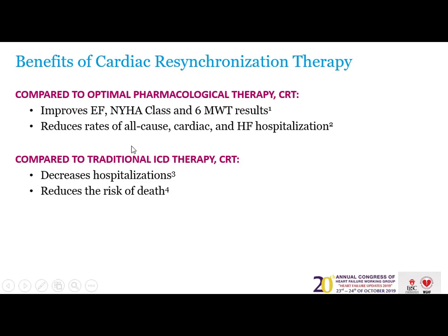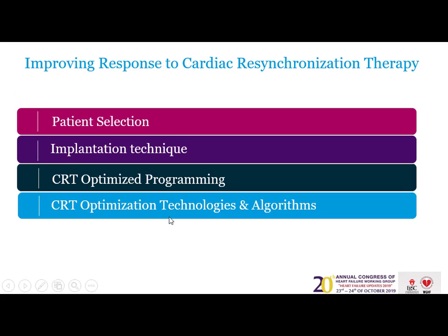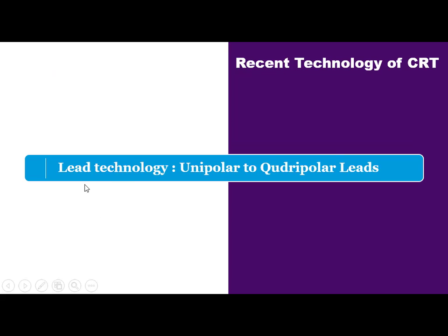As we know, CRT reduces all-cause mortality, cardiac and heart failure hospitalization, and compared to ICD, it decreases hospitalization and also decreases the risk of death. Improving the response to cardiac resynchronization therapy by the technology started by improving the lead technology.